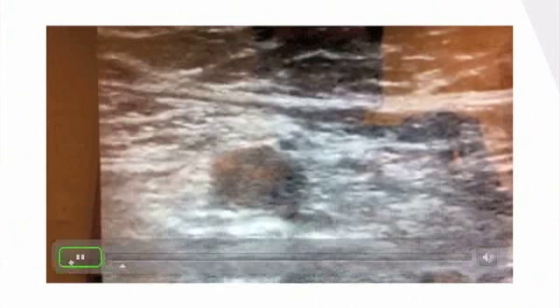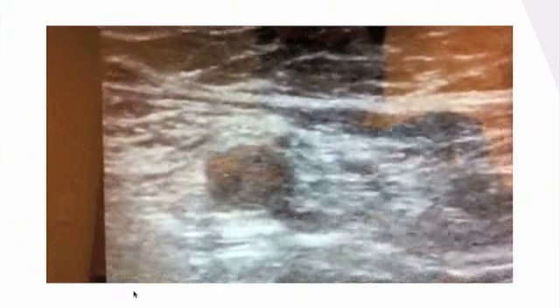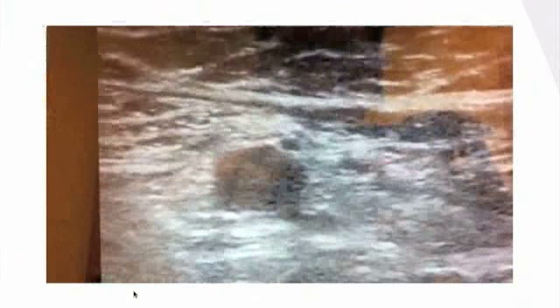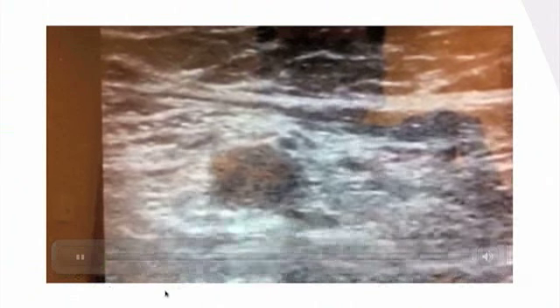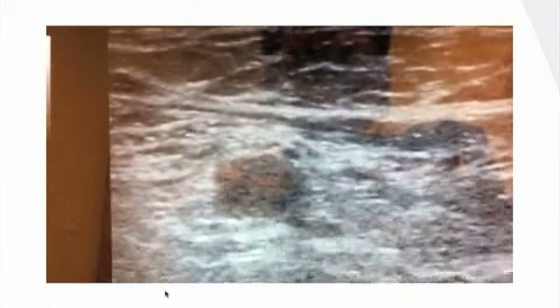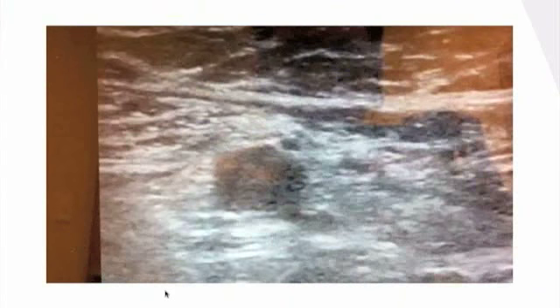Here's another video. What do you think about this? See a pulsating artery? I can't tell. The quality of this video is way too bad. So it looks like there's something inside the vein there. So like right next to it, yeah, there's that. Again, there's more schmutz. The schmutz sign. We need more schmutz signs in medicine. What do you think? Yeah, as many as you can come up with. Yeah, so you're right. DVT right there. That vein is full of clot.